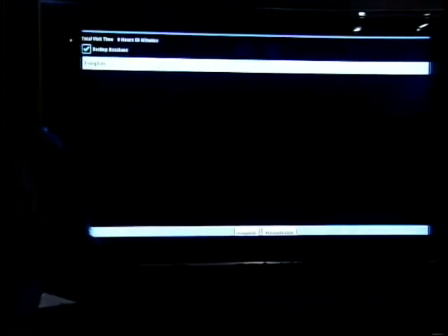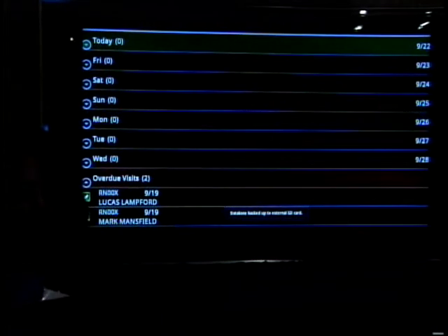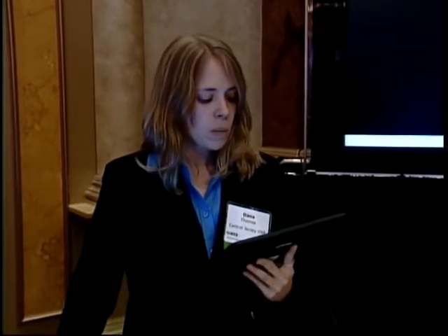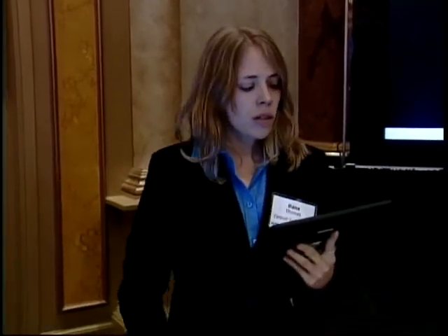The patient would sign. And I'm going to synchronize this back to my office side. And from there, we'll upload the document to the HIE. Once I get it on there and you move to Sita's table, she's going to show you the document I uploaded with all of our orders, medications, diagnoses, interventions, goals, more home care based things. So this will just take a minute. The synchronization's pretty quick. It goes back over Verizon to the servers.